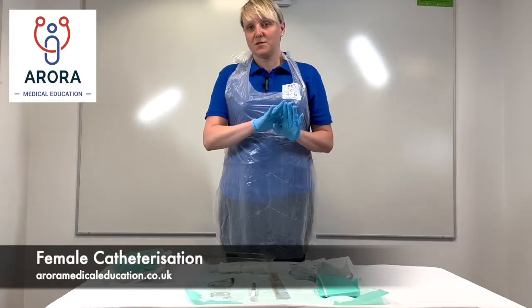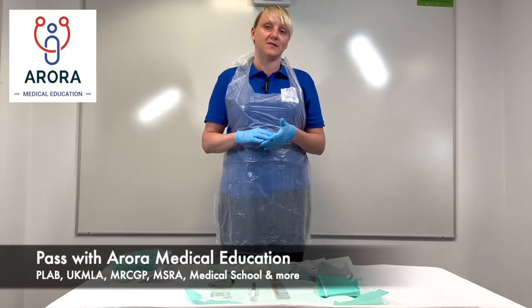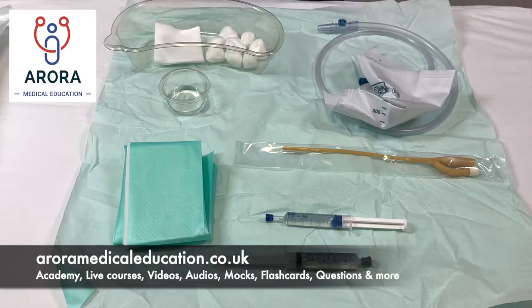In this video we're going to go through female catheterization. We'll start off by going through all the equipment that we need, then we'll go through step by step how to insert the catheter, and then we'll go through a full run-through at the end.